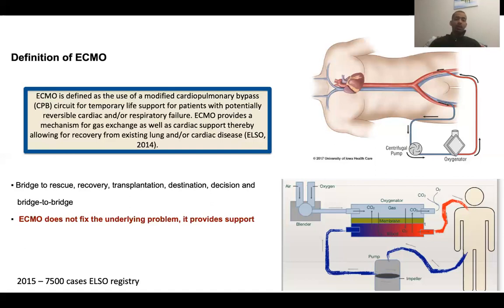and there's hardly activity from the heart that's pushing things against the gradient, and then as you see the reoxygenated blood coming up the femoral artery on the left side of this patient will eventually actually feed the femoral artery or the iliac artery of the right side, and some of the blood continues to actually go down this leg. And if there is poor circulation down this leg, then you can always use an additional cannula that goes down the artery on the left leg. It's called a distal perfusion cannula.